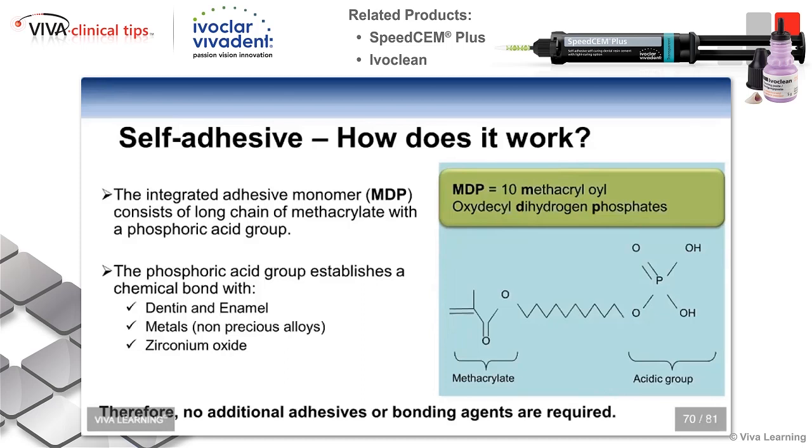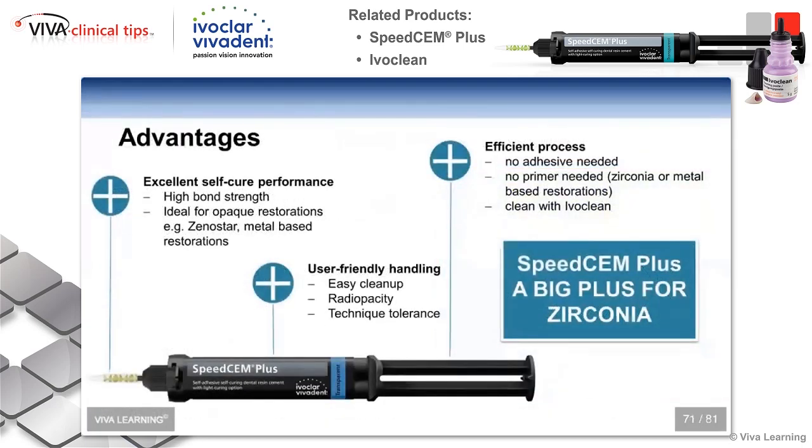Now you would think that that name, the 10-MDP, would be one of the CE questions, but it's not, because I don't trust you guys to remember it. And you say, well, Mike, you're just reading it off the slide. What's the big deal? Well, watch this. I'm going to change the slide, and I can still say methacryloyloxydecyl dihydrogen phosphate.